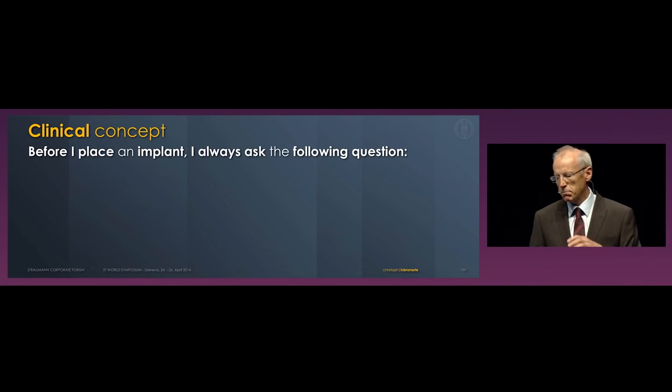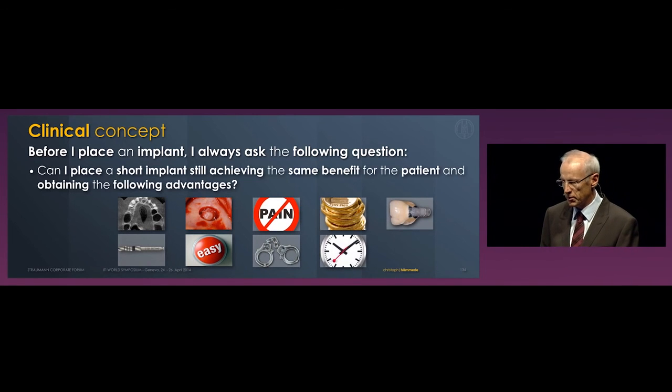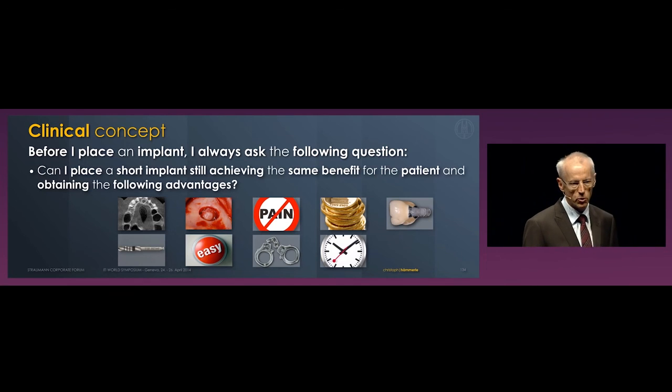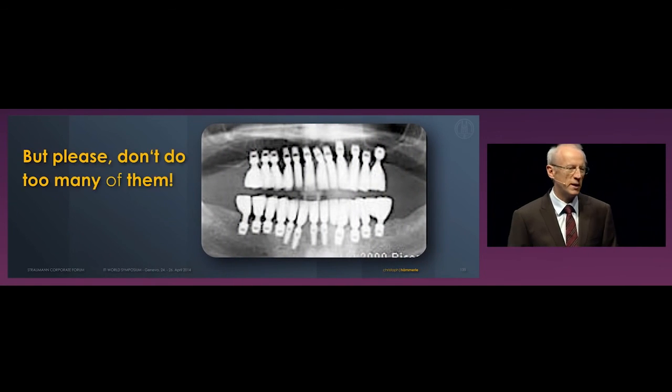The clinical concept. Before I place an implant, I always ask myself, can I place a short implant, still achieving the same benefit for the patient, and obtaining the following advantages? And we've listed them before. But please, don't do too many of them.